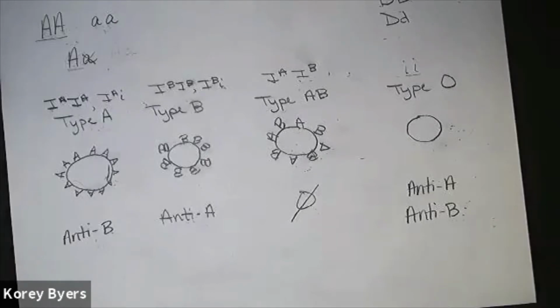I thought O negative was the true one. It is. Positive can't do all of that. We've not gotten to positive negative yet. That's the next step. But you are absolutely correct. O negative is the universal donor.